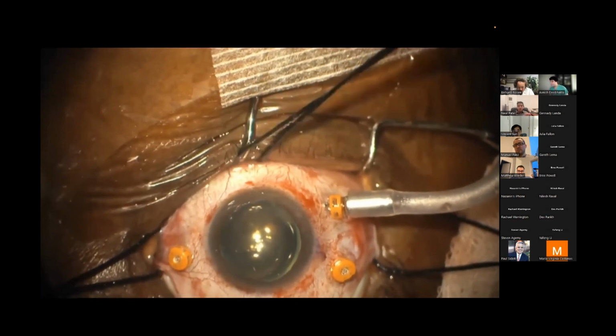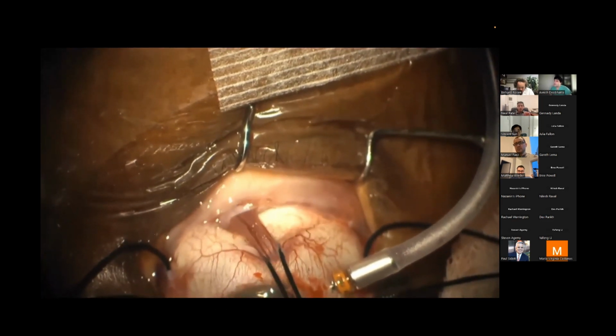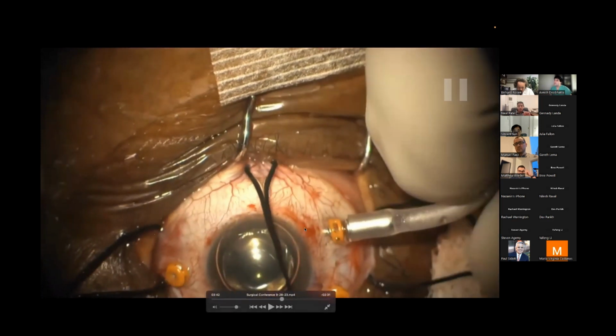But then here, as we tug on that inferior rectus to superduct the eye, and we release it, we see an air bubble in the anterior chamber. And so we actually didn't realize this at the time, but we will realize this later.